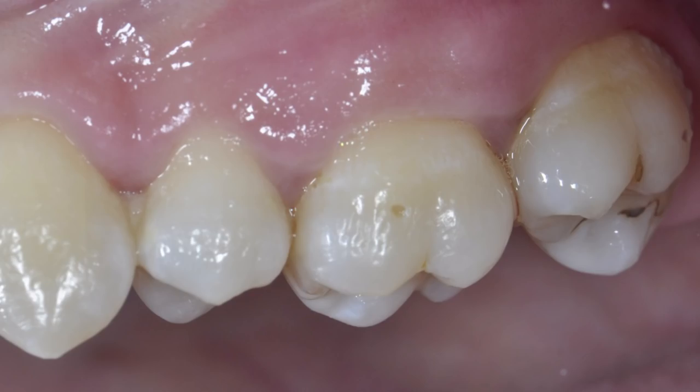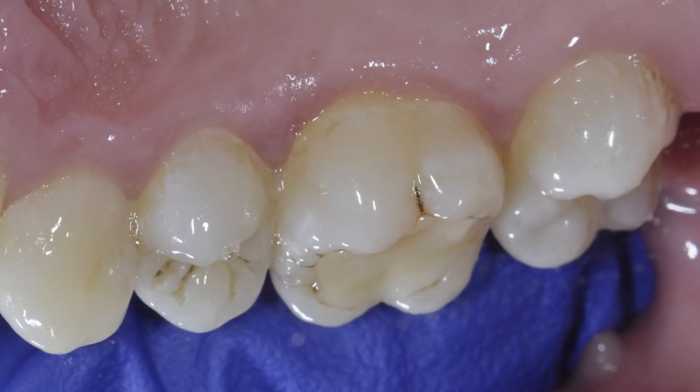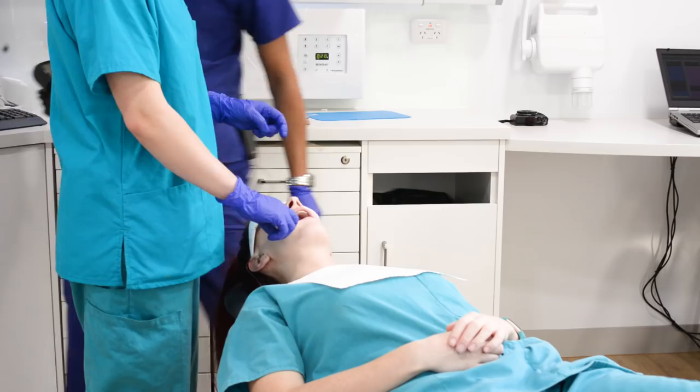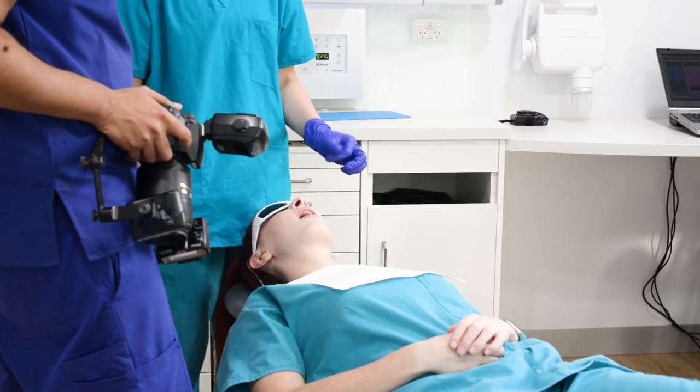Now quadrant two — the same sort of thing: occlusal, palatal, and buccal. Then quadrant three and quadrant four occlusals as well. Obviously if there's lots of saliva you can dry that out too.